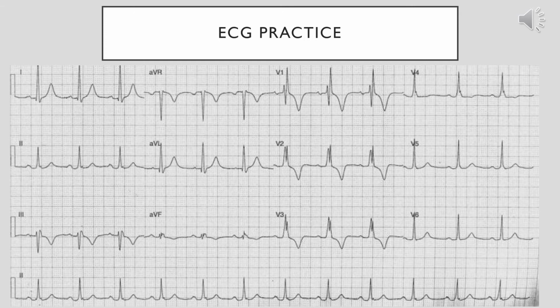Looking at any kind of ST segment changes, we want to look through all our leads to see if there's any ST elevation or depression. On here, I'm not seeing a significant ST elevation on any of these leads, so that's good.